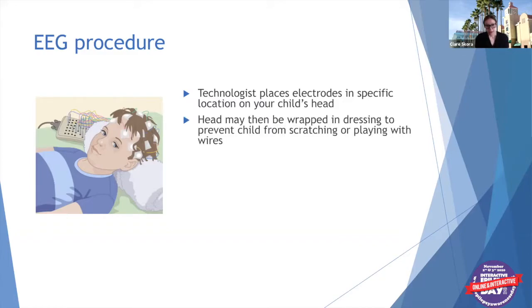Depending on how long the EEG will last, sometimes a more durable dressing or bandages is put on the head around the leads to prevent the child from scratching at them or pulling them off, particularly if the EEG is going to be lasting more than a few hours or even days.